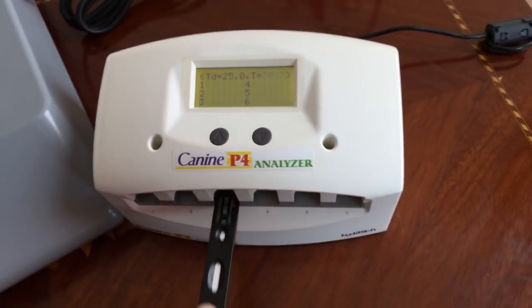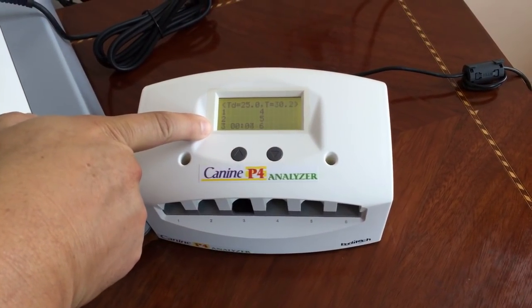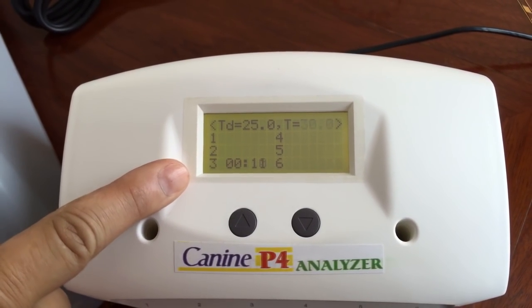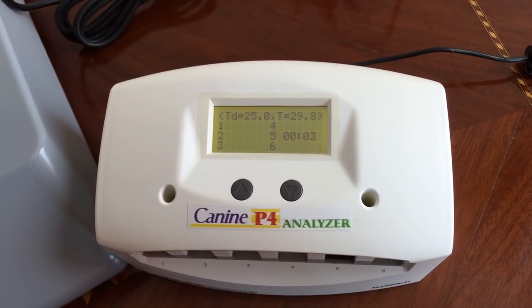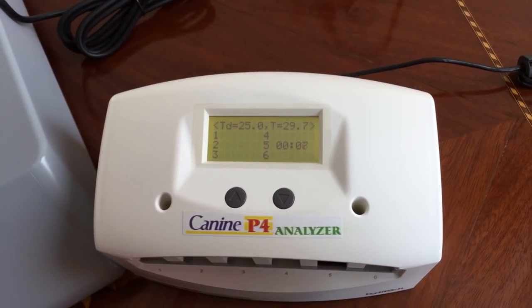When you put in this strip, you'll see that the timer starts going. When it reaches 15 minutes, the alarm will go off. Whenever you place a strip in any slot, the individual timer will start, so you have both a timer and an incubation function.